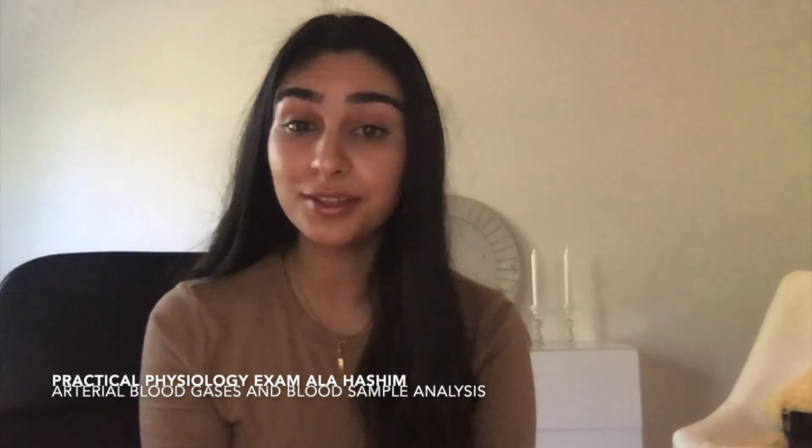Okay, so today I'm going to talk about arterial blood gases and analysis of some blood samples. And what is this whole question about? It's basically about that you can perform an ABG test, which is an arterial blood gas test. This test is mainly performed on patients who might have breathing problems or respiratory problems, such as asthma or cystic fibrosis or chronic obstructive pulmonary disease.